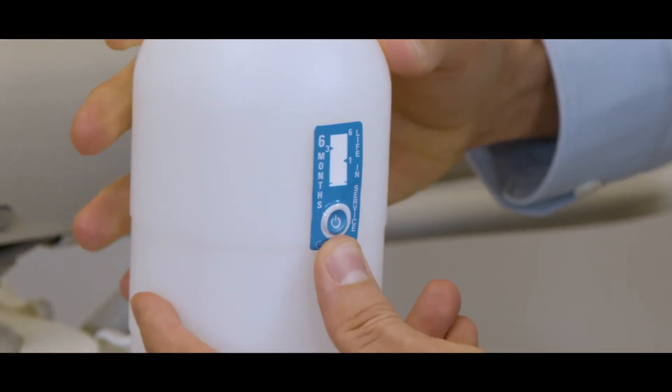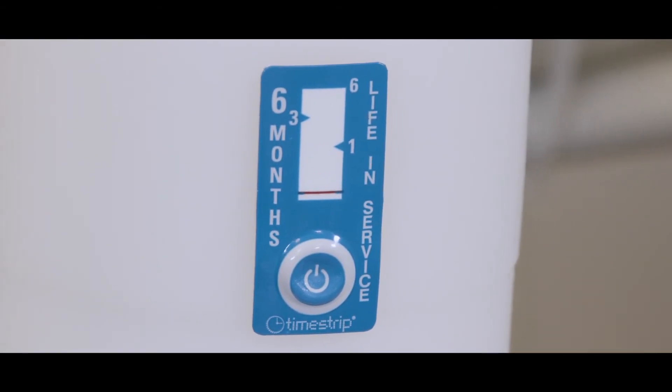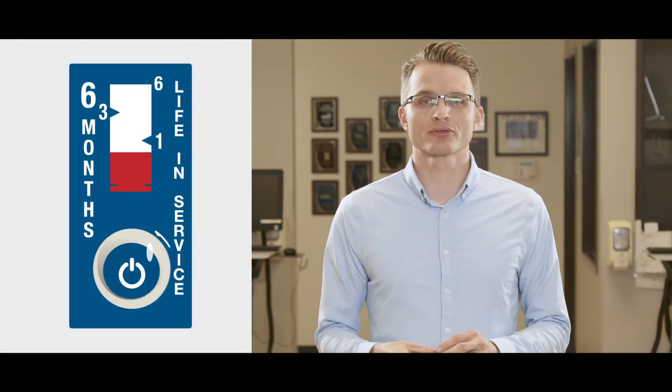In less than a minute you will start to see the white window begin to fill with red. Over the course of the next six months, this window will continue to fill with red, and once it's fully red you know it's been six months and it's time to replace your blue tube. Additionally, make a note of the date you installed the blue tube cartridge in your maintenance calendar to document and verify the correct replacement timing.